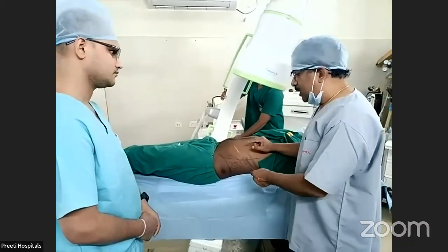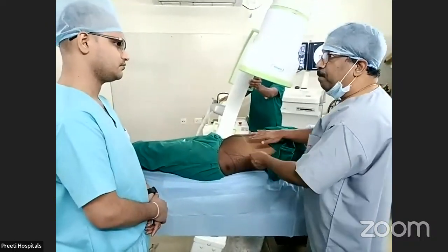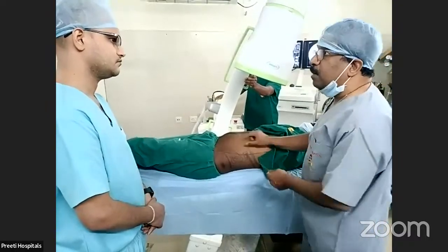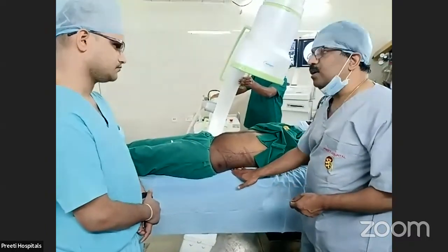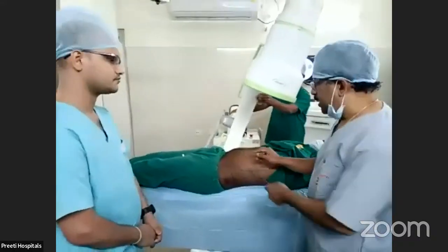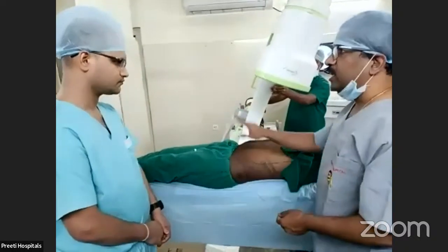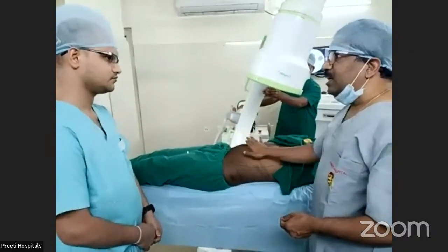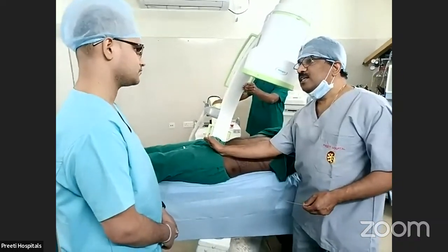What will happen if the needle goes up on the screen, compared to the stone? What does it mean? Posterior. That means you are on the back side, and you have to go more anterior. If the needle goes down on the screen, you are more anterior, which is dangerous. You should not be anterior, so the needle should never go down on the screen.